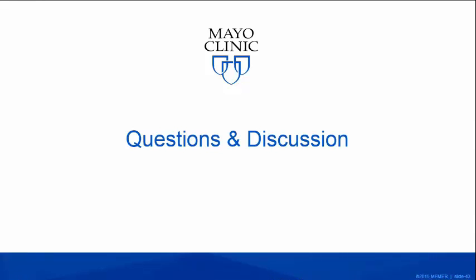I was interested that you're doing a fibrin monomer test. Are you doing that by ethanol gelation, or is that another assay? I think your question, I can't hear because of echo, is about the soluble fibrin monomer test and which method we use. Yeah, which method do you use? This is a latex immunoassay with an antibody. It's not the same as the traditional test which actually detected soluble fibrin.